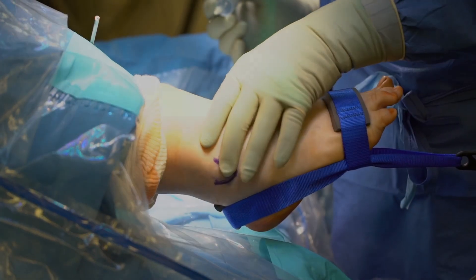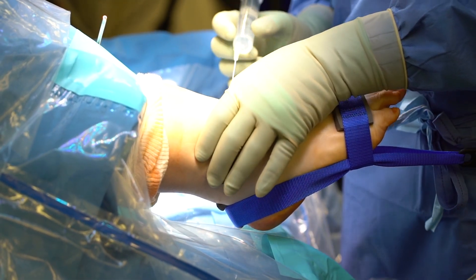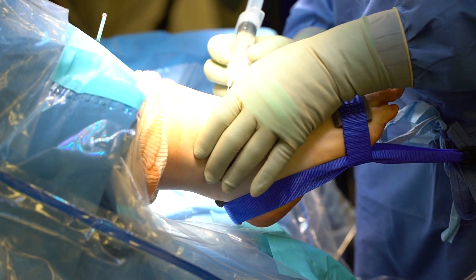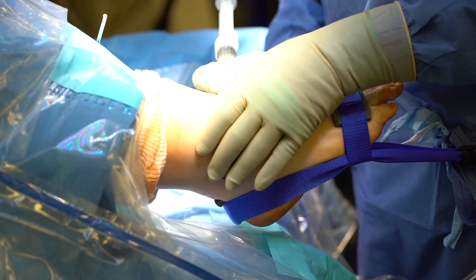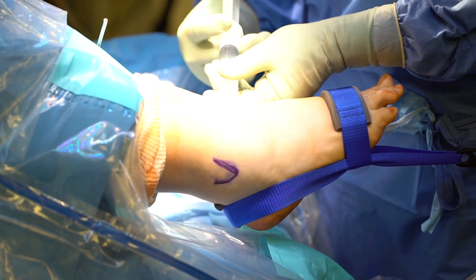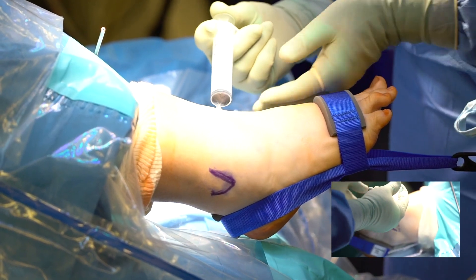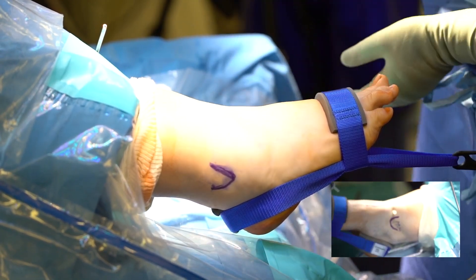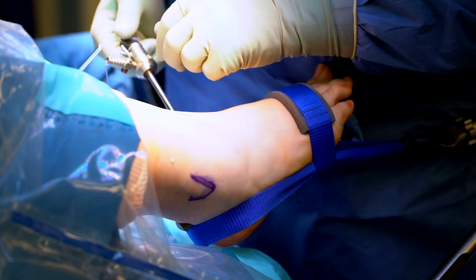The surgical setup uses Gould's distractor. Medial and lateral portals have been outlined; this is the medial portal. 20 ml of saline is infiltrated just medial to the tibialis anterior tendon in the soft spot, and the egress of fluid confirms that we are in the joint.